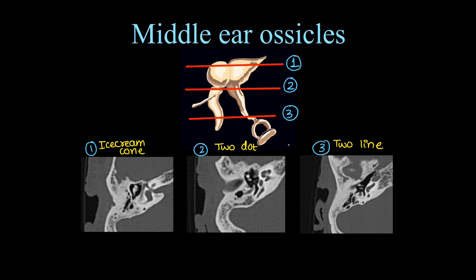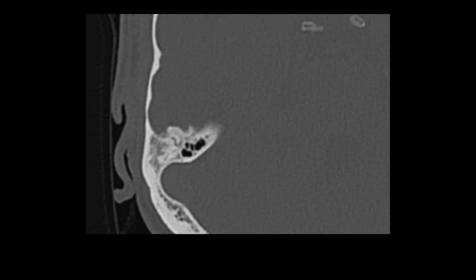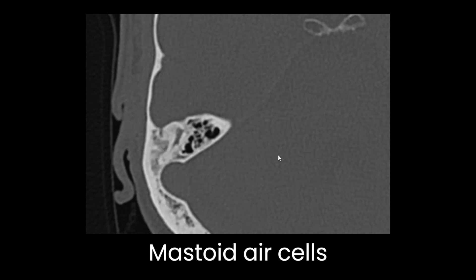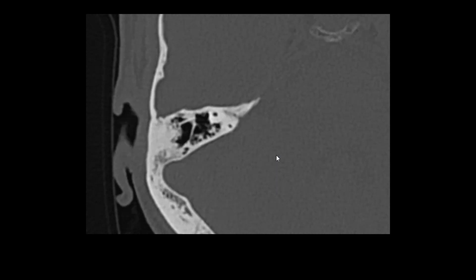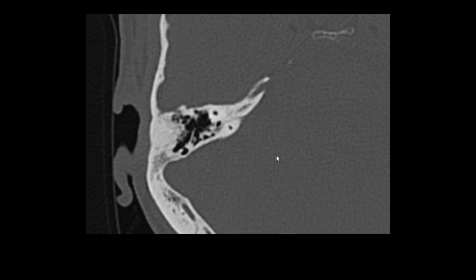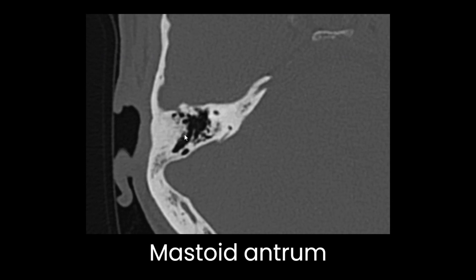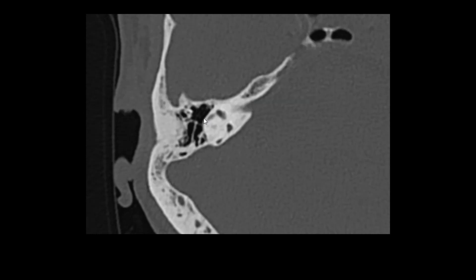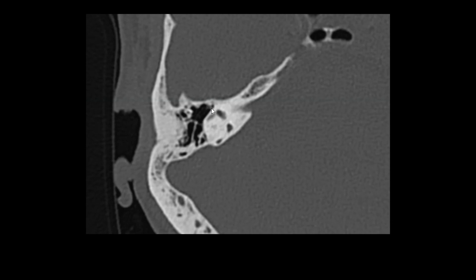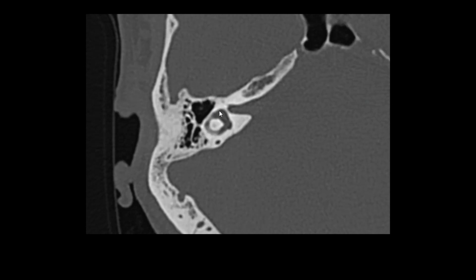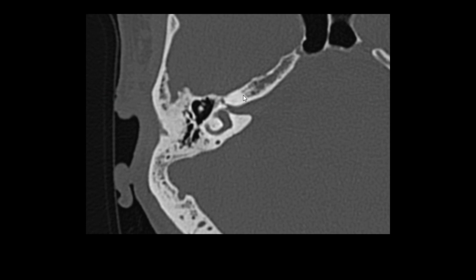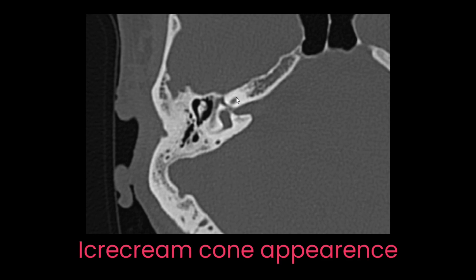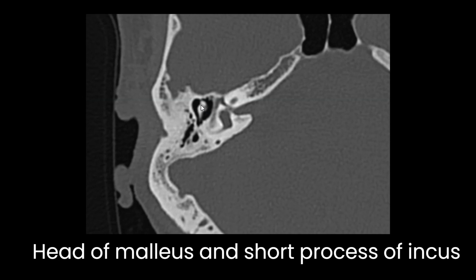Scrolling through axial HRCT sections: we start with the mastoid part with mastoid air cells. As we move down, the middle ear starts appearing. Here we have the mastoid antrum — the largest mastoid air cell communicating with the middle ear — and that communication is called the aditus. Moving further down, we start seeing the ossicles, and here is the first standard section — the ice cream cone appearance — with the head of malleus anteriorly and the short process of incus posteriorly.